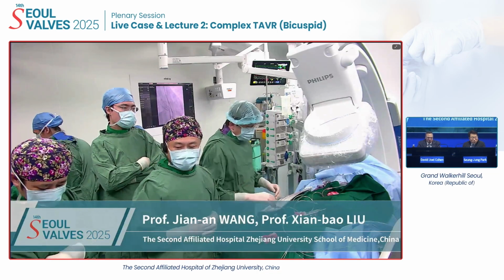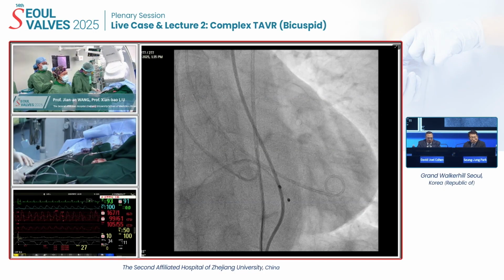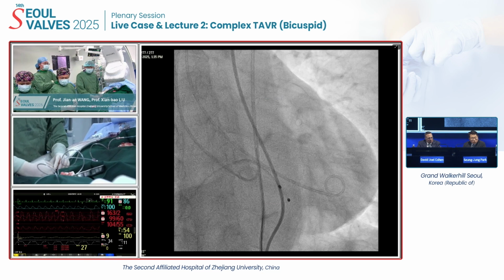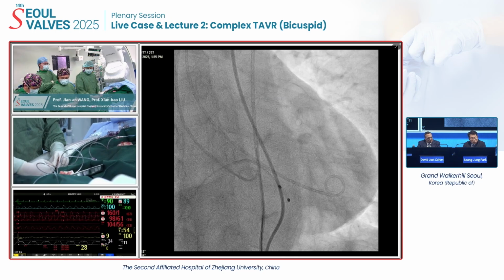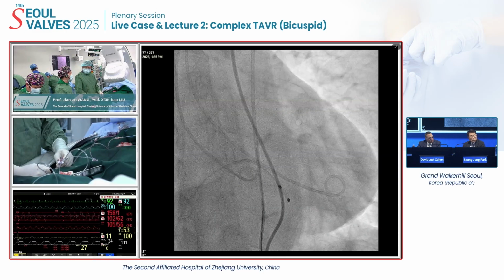Professor Wang, I would like to have your comments on our next step, just around several discussion points. If the patient is yours, what is your next step? Are you going to do the balloon inflation or not? If you agree with balloon inflation before the device implantation, which size of balloon do you prefer for the patient? For this patient, we will use a 26 balloon expander.